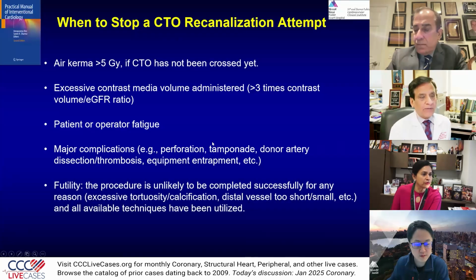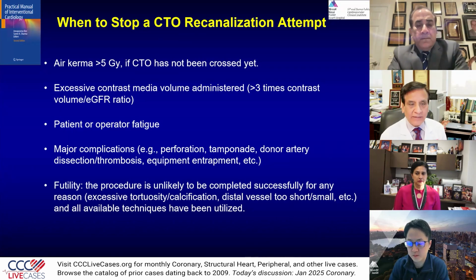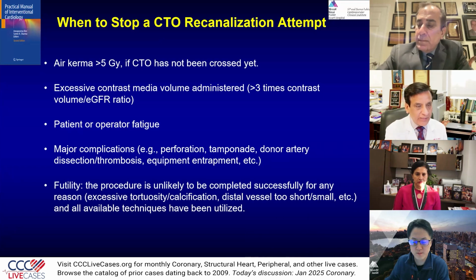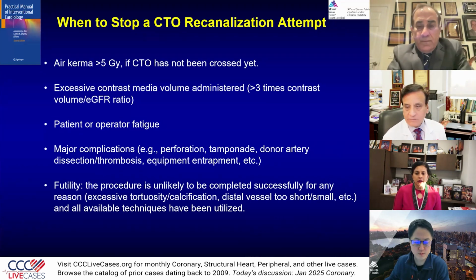I can tell you, a very educational case in terms of how IVUS, even though we did it at the end, taught us a lot. And Kiski has really masterfully demonstrated how we were in the true lumen, then subintimal, and then went back into the true lumen, which is phenomenal. Very limited dissection at the ostium of the LAD, but the left main was in the true lumen. Fantastic. This is just a final slide to say, yes, you can do CTOs.